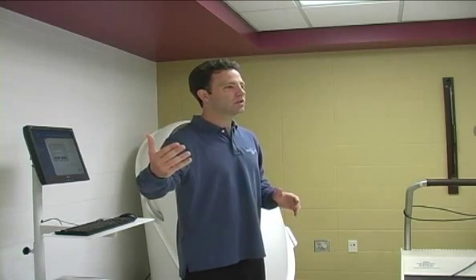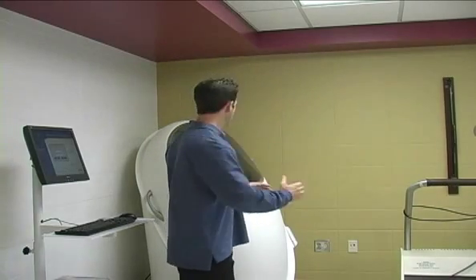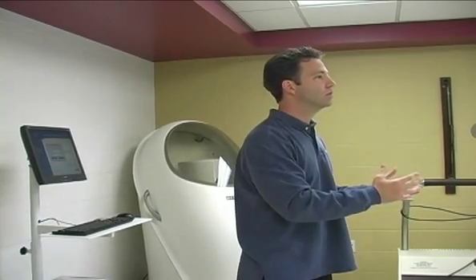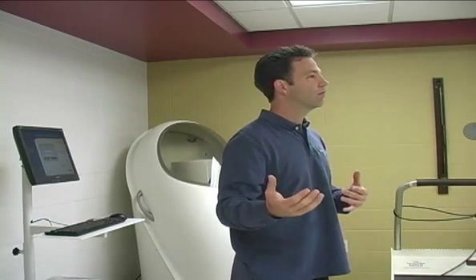Really, DEXA is great for a bone scan, osteoporosis. That's their forte. You can load software onto the DEXA to then do body composition, but hydrostatic weighing and the BOD pod, that is what they were created for, is body composition. And incidentally, hydrostatic weighing compares favorably to a multi-compartment model or a 4-compartment model as well. Does that answer your question?